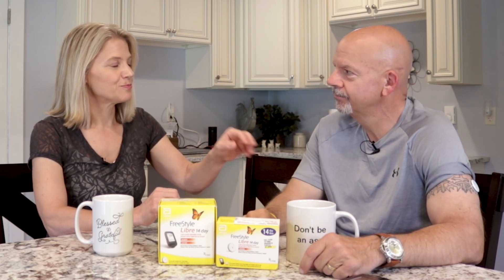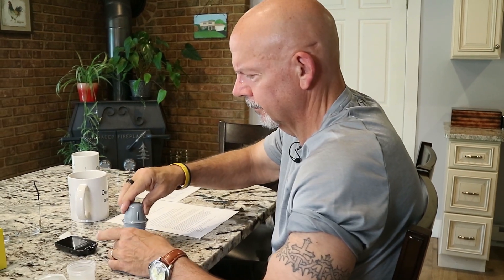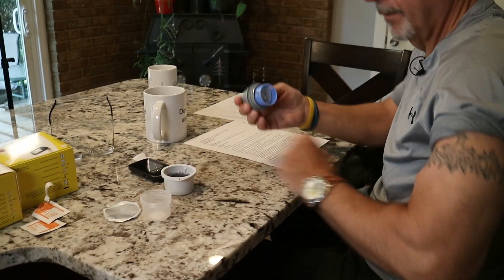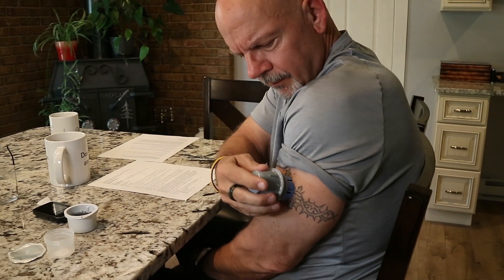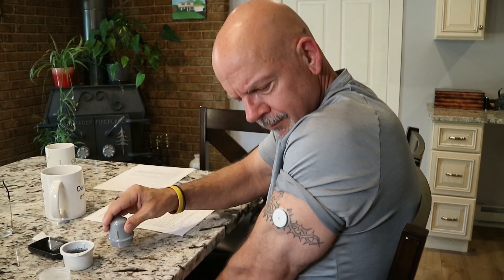We just put that on just a few minutes ago. Did it hurt? It did not hurt. It actually has a 5-millimeter-long filament that goes into you, into your tissue, which is about a quarter of an inch. I was expecting it to hurt, but I really didn't feel it at all. No, you didn't flinch — so you were brave. I was manly.